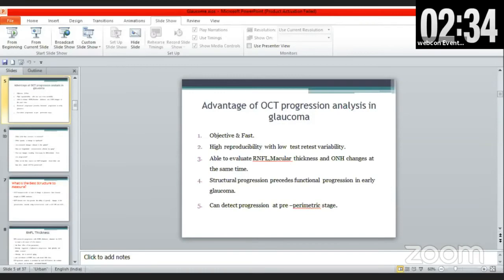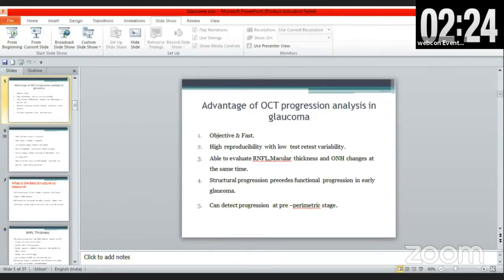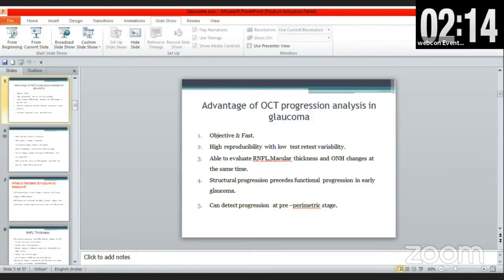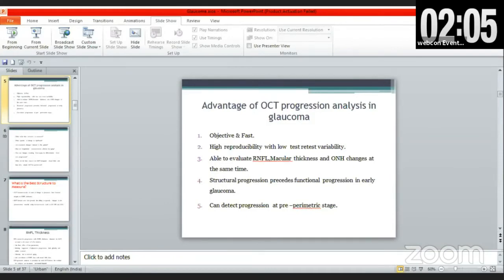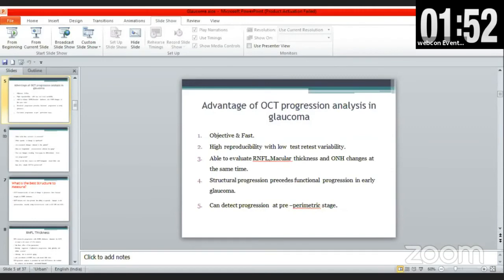Combining structure and function: structural changes in glaucoma are commonly accompanied by functional loss, which may ultimately result in significant visual reduction. Standard automated perimetry remains the established approach for monitoring functional glaucoma loss. The question is how much damage needs to occur before detection is clinically possible. A Spectralis OCT trend-based analysis shows RNFL thickness measurements at various time points and ages, with any negative slope indicating possible progression.